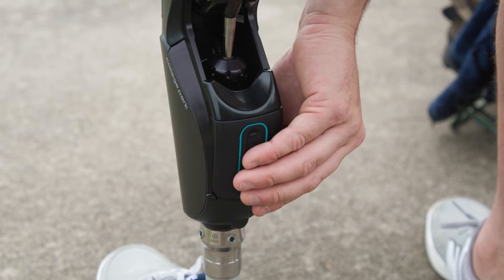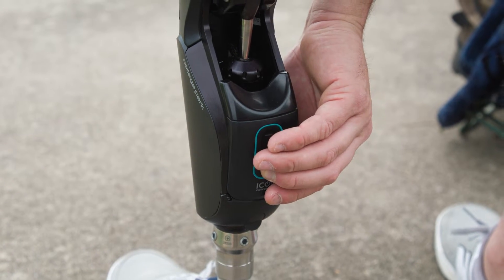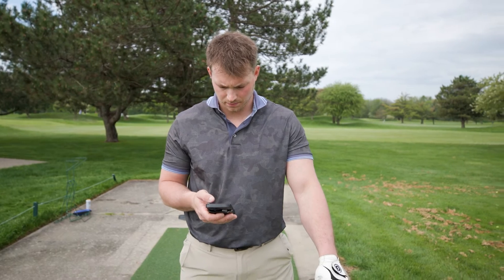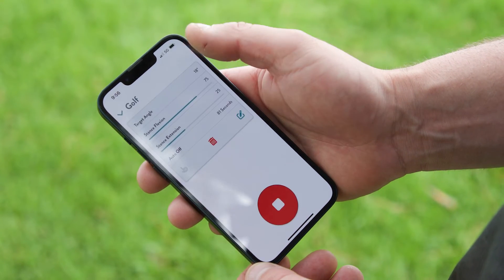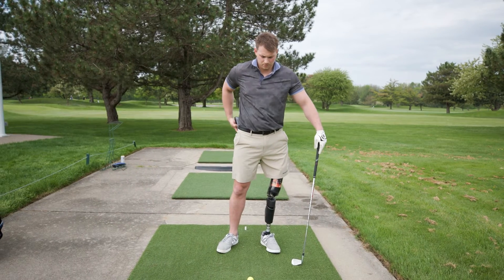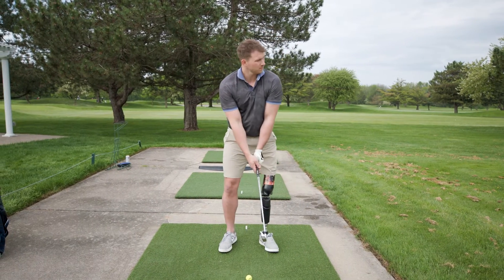There are two ways to enter into the modes. One is on the back of the knee — there's a button where you can hold it for three seconds and it switches into your custom mode. Another is on the app Stride Studio: go into the activity modes, switch it to your custom mode, click back out of it, and it goes right back into your basic walking mode.